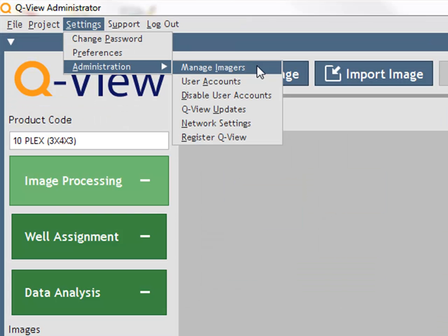When logged in as an administrator, you can adjust the following settings. Manage imagers allows you to discover, name, focus, and calibrate QView imagers.